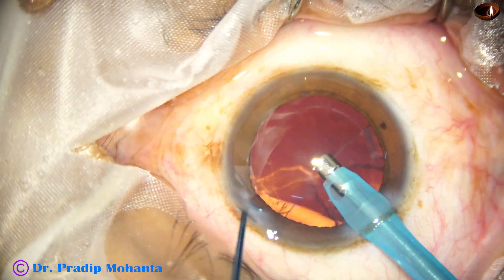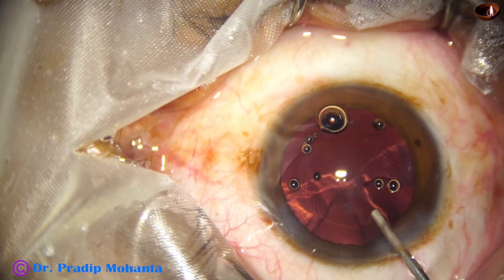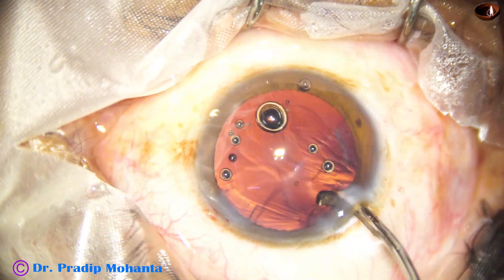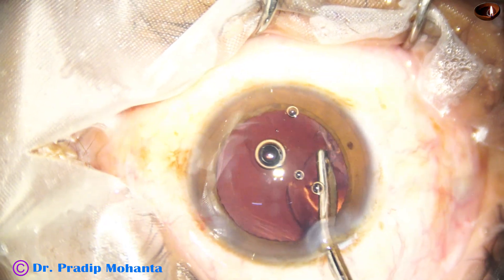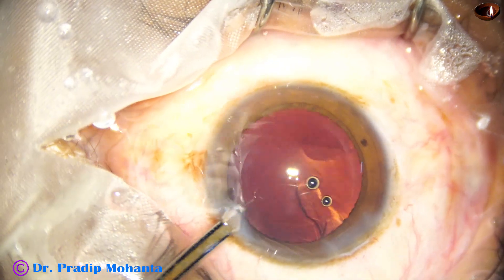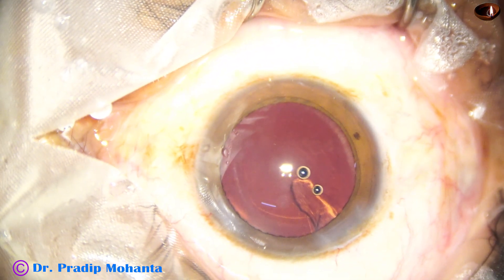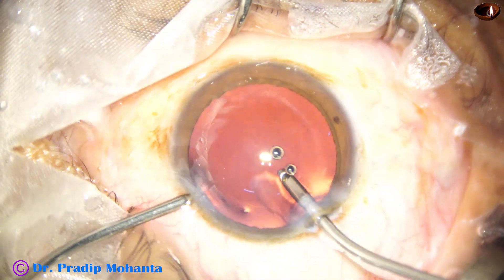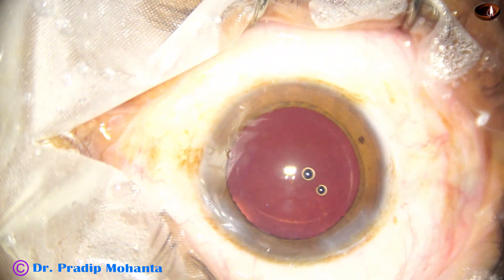Almost half of the cortex has been removed. Inject a little more visco, and now I use Simcoe cannula to remove this cortex. Most of the cortex is removed. There is a spec just underneath the main wound — the side port is small and it does not go through the side port. So I take the bi-manual irrigation-aspiration, place the irrigation through the main wound, and the aspiration in a few seconds removes the sub-incisional cortex.